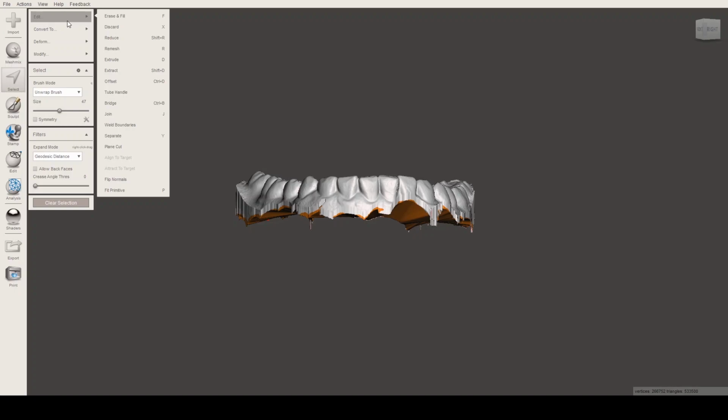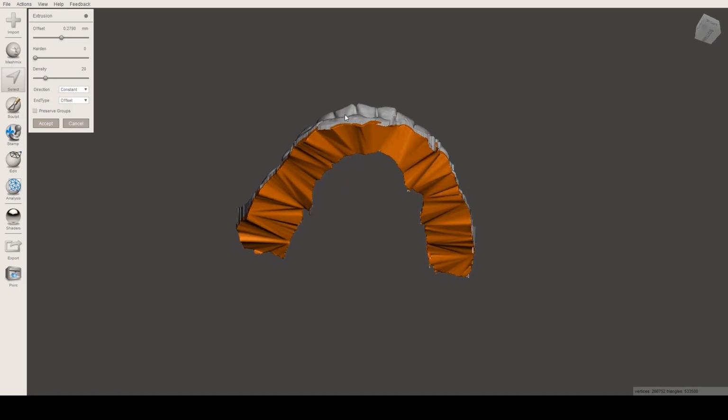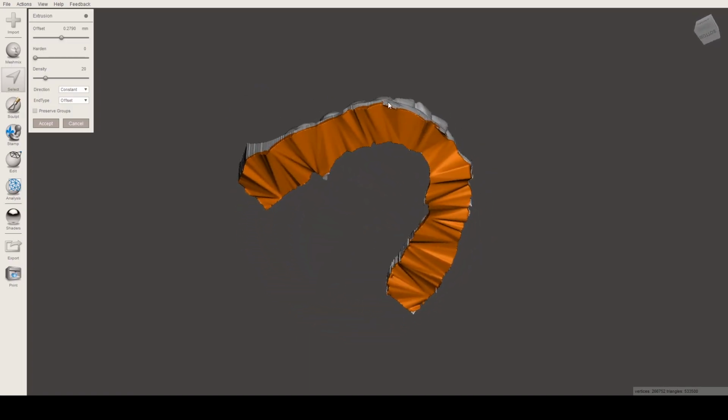So the way to extrude is, go to your, select it. We selected an area. That's the first step. Select an area that you want to extrude, and just go to the edit menu and then extrude. Or you can press D if you want. Extract will just remove it. That's what extract does. It's the opposite of extrude.